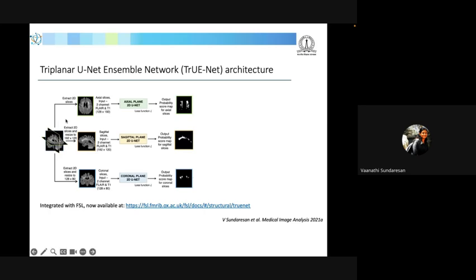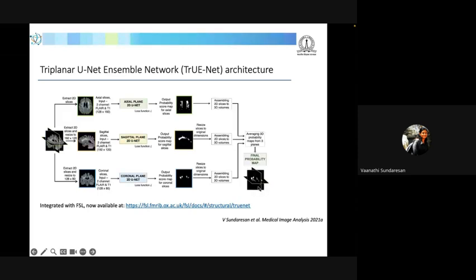NumPy arrays because I work in Python. These images will be 3D NumPy arrays from which I will get the 2D slices, again NumPy arrays, and then I will get the output as NumPy arrays, and then I will combine them again as the 3D input, and this 3D input I will convert back to Nifty. So DICOM, we don't get images as DICOM, especially MR from this particular hospital. CT images we used to get, but in India, I'm observing that DICOM is more commonly used. But we can also apply this on DICOM images also.